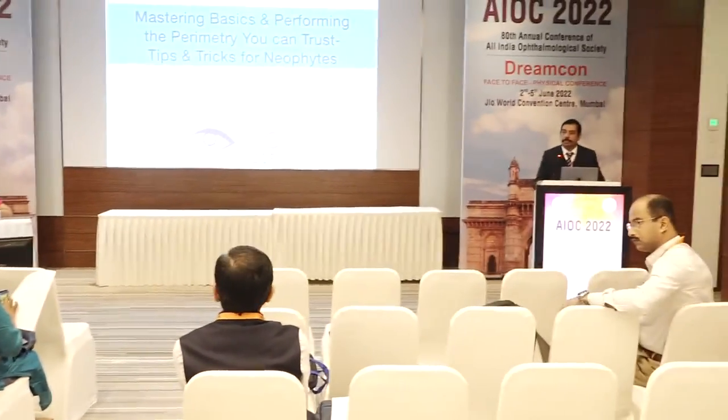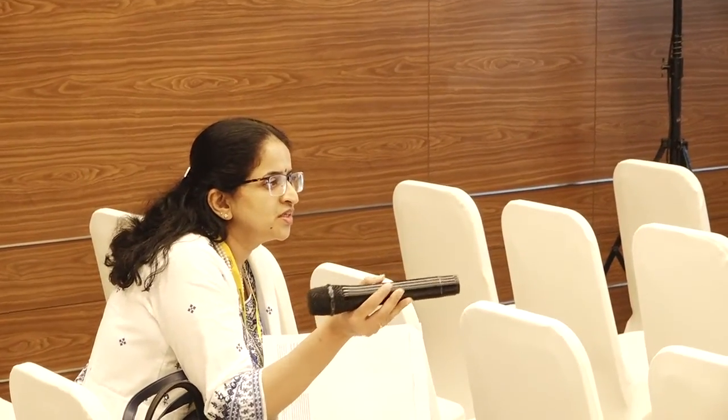One last question. Yeah, please. Before you go, what about myopic discs? You get all these weird discs, which was addressed in the last talk. Yeah, progression in myopic discs is very hard. You can do it the same way, because we are looking at the BMO points rather than the clinical disc margin. That is the biggest advantage of looking at the BMO points. And when you are in doubt, you can always look at the GCL maps also.